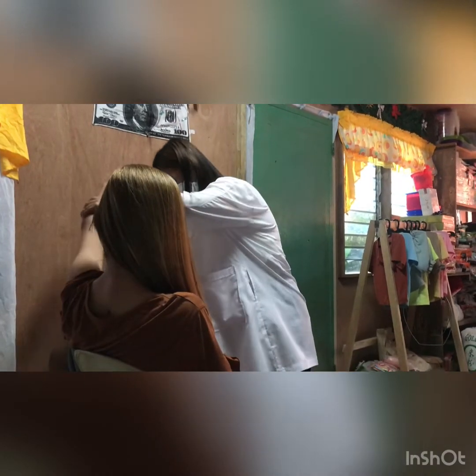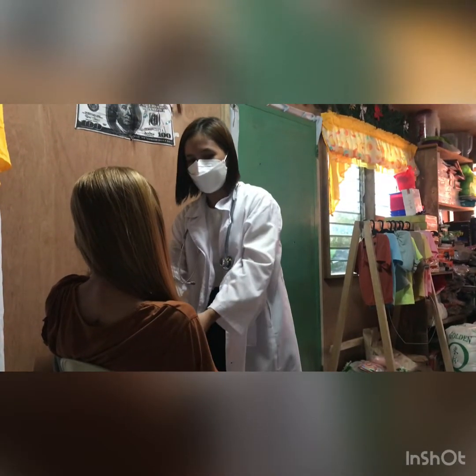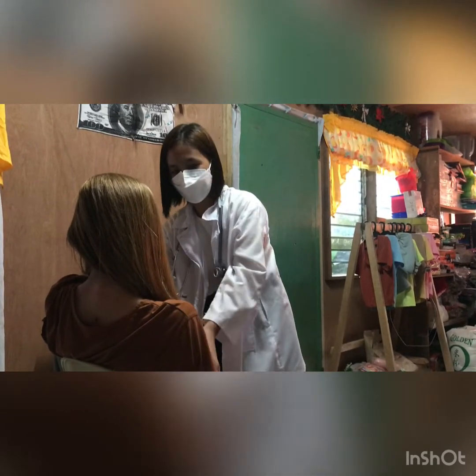Okay, can you raise your arm? And after that, assist the patient to place their arm tightly across the abdomen to keep the thermometer in place.